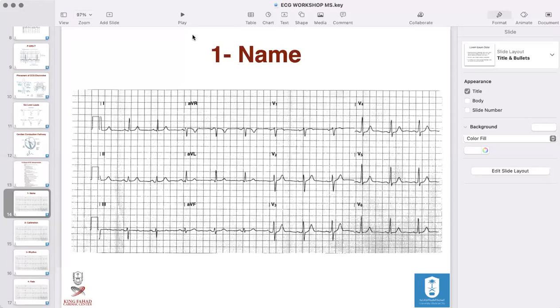And that's helpful. For example, for calculations, probably they are more accurate than us humans. But make sure, the problem with the computer is it analyzes whatever you give it. And the algorithms are getting better and better, and also some machines are using artificial intelligence. But so far, you want to make sure that the data is right before you really embark on what the computer says. And that's a frequent problem.